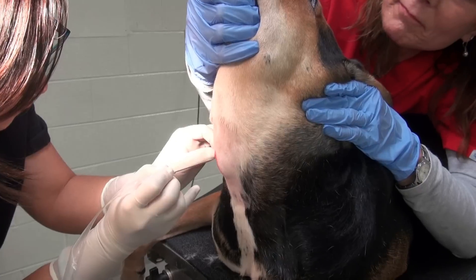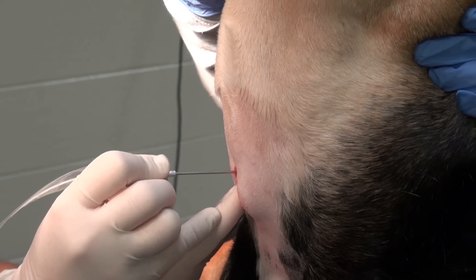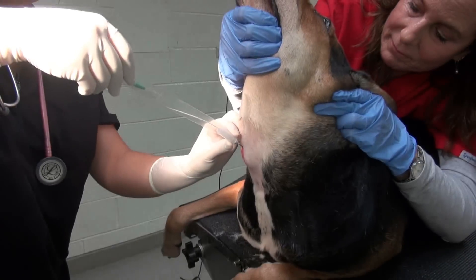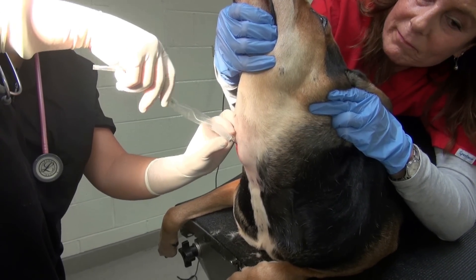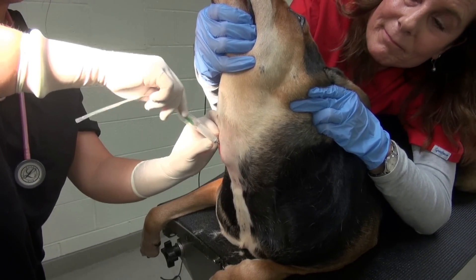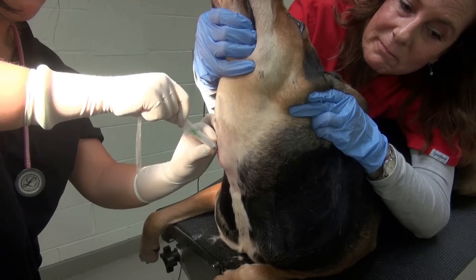On another attempt, go through the same small hole in the skin and repalpate the landmarks, learning from the previous attempt. This time the needle goes in very easily — a good sign of correct placement. Most dogs will start coughing when the catheter goes down the trachea, and that is another strong indicator of correct position. Slide the catheter through its sterile sheath all the way to the needle until the green catheter hub is seated on the needle hub.